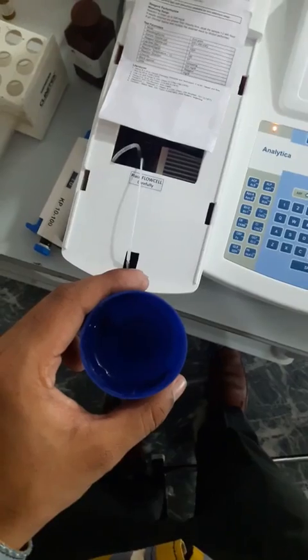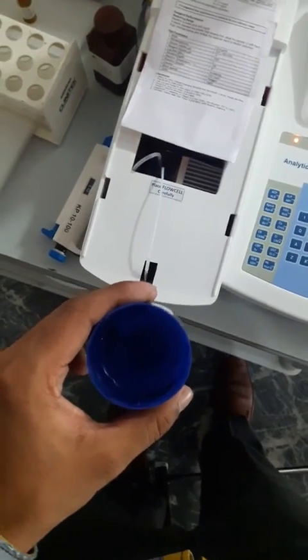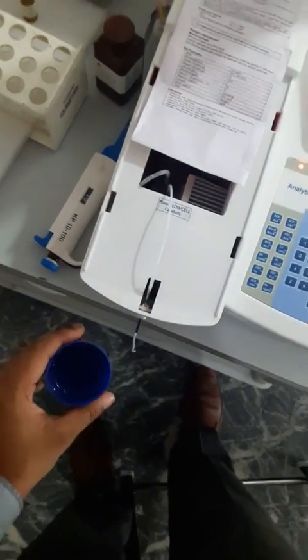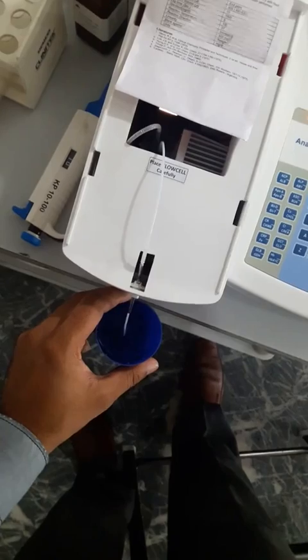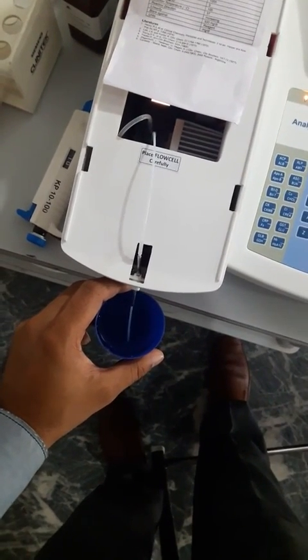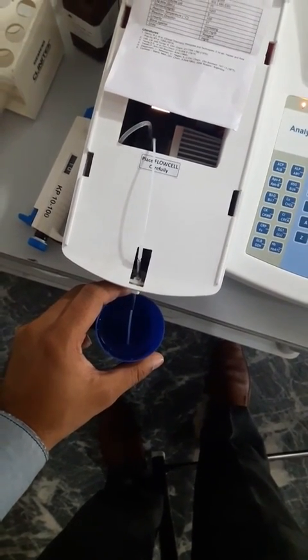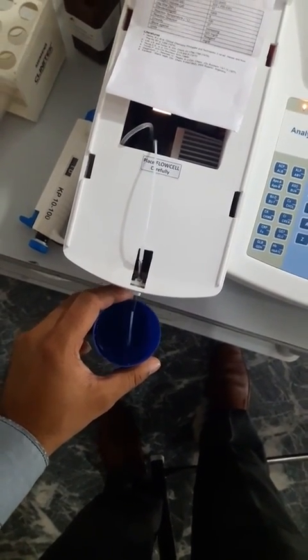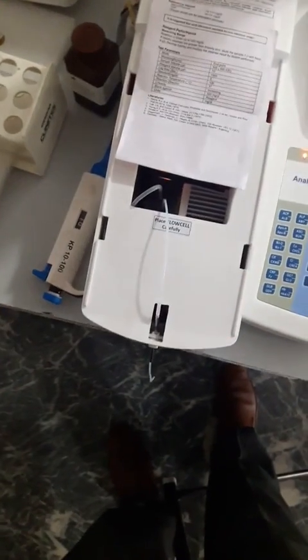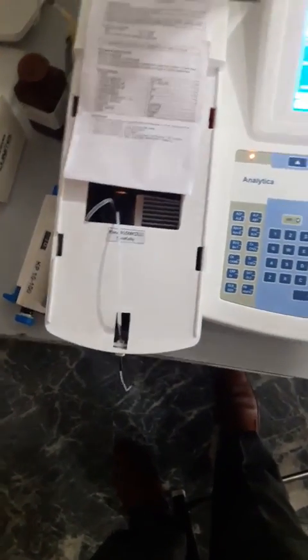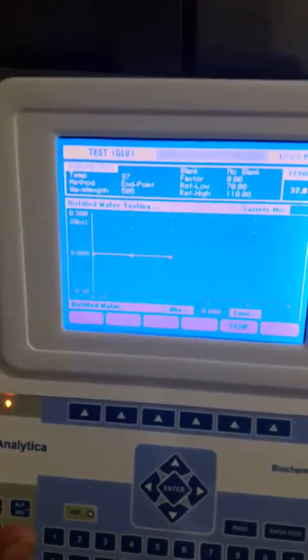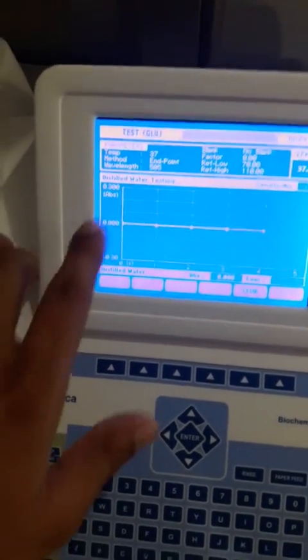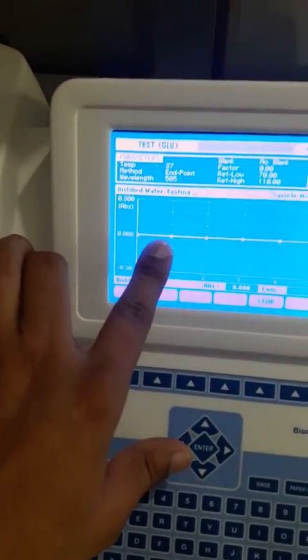Here we have the distilled water and now I am going to aspirate it. The beep sound is the indication that aspiration has been completed, and now it will test the distilled water.